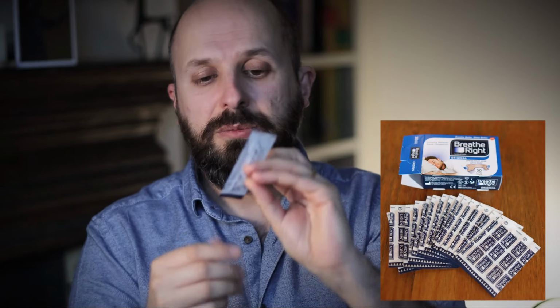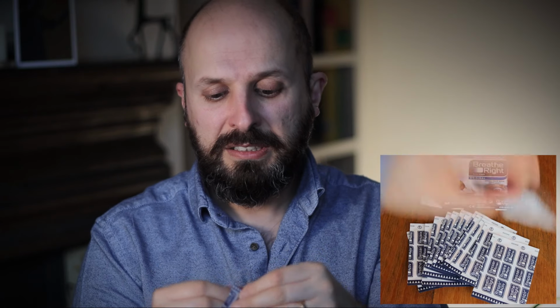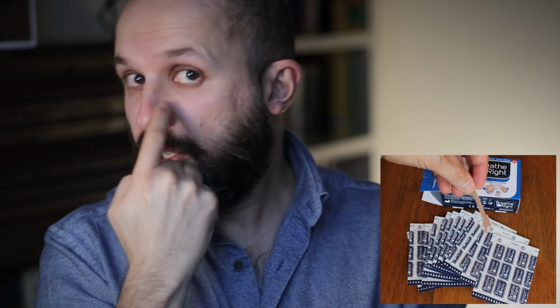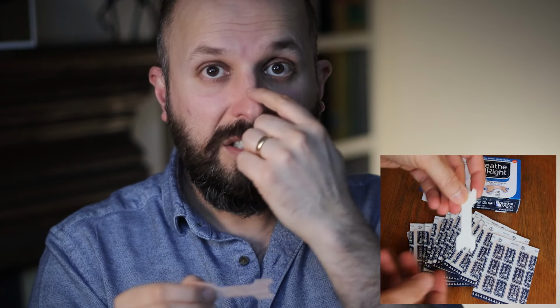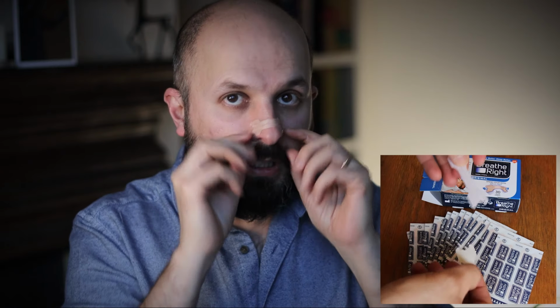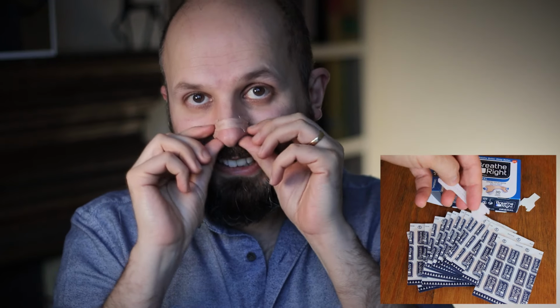You get what looks like a bit of a plaster with a relatively firm middle part. What you do is you're aiming for this part of your nose here, the depression on both sides, and this goes over the top of your nose. So aim it just about there. What you're doing is opening it up like that, and you can see it does lift it up away from the midline partition without something going into your nose.